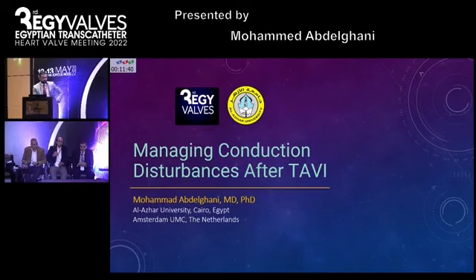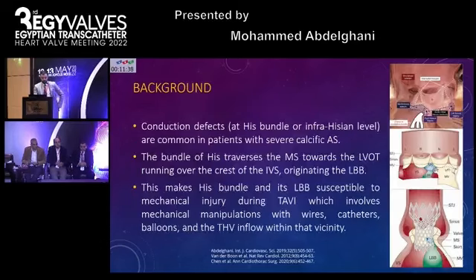And my topic today is managing conduction disturbances after TAVI. To understand why this remains an important issue in TAVI patients, we have to realize that conduction defects already exist in these patients at baseline, before they undergo the procedure.